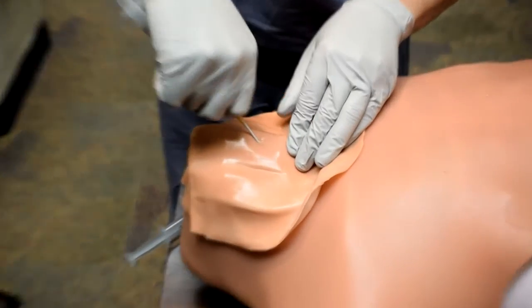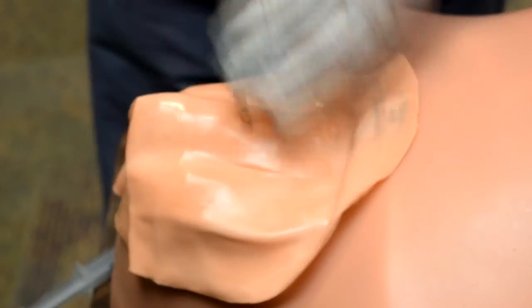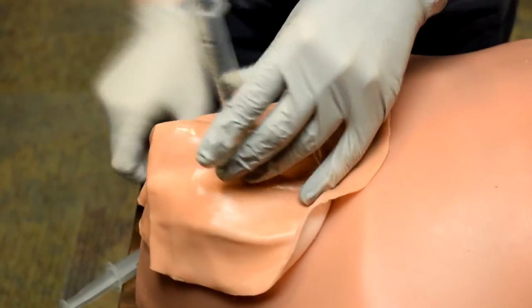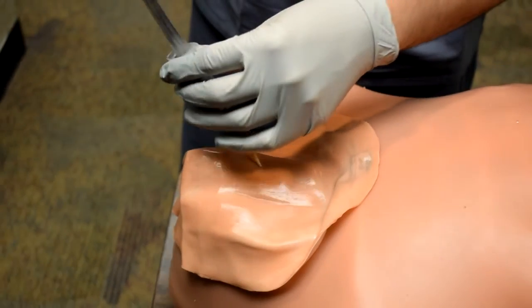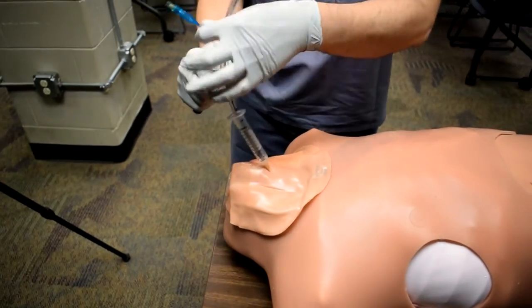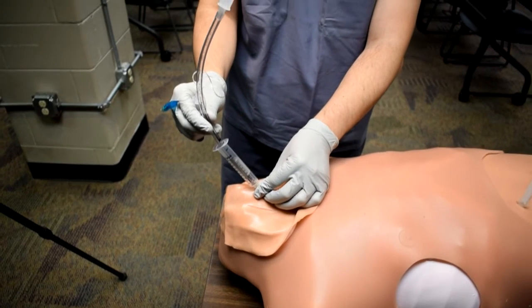Slide the angiocath forward. Take the plunger out of the syringe. Attach the syringe to the angiocath. ET tube into the syringe. Inflate the cuff. And then I can attach my endotracheal tube to a BVM.